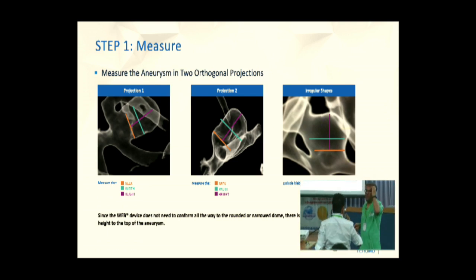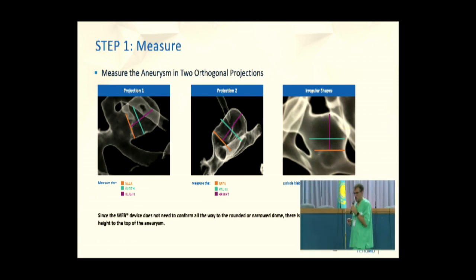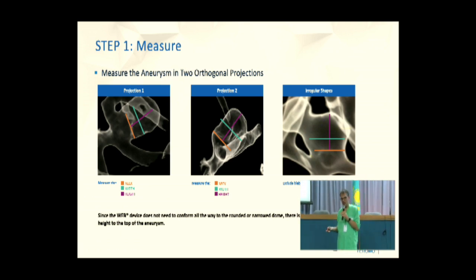Do you sometimes use a stent with the web, or is it always a balloon to reposition? Sometimes you're not happy, or you have a recurrence at about 12 months follow-up. Do you plan to put a stent also? So in general, the good thing about the web is that you can deploy it, look at it, and you only detach if you're happy with it. If not, you can reposition it or even exchange the device if necessary.